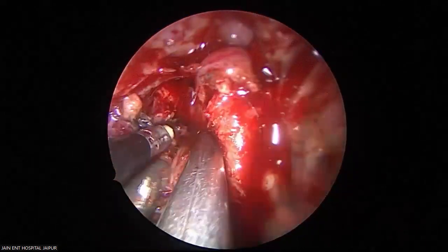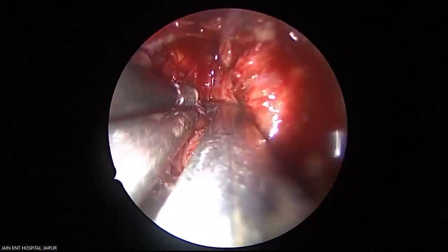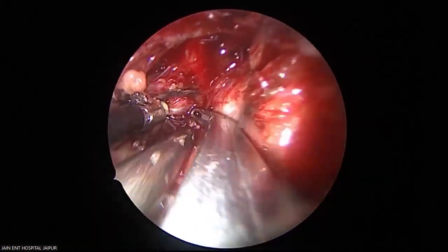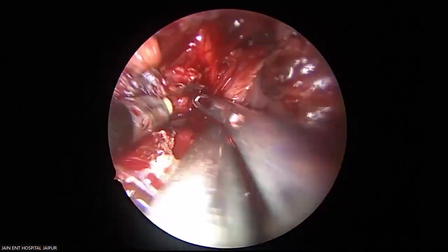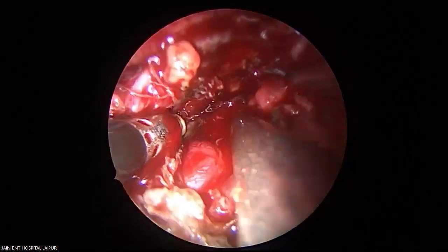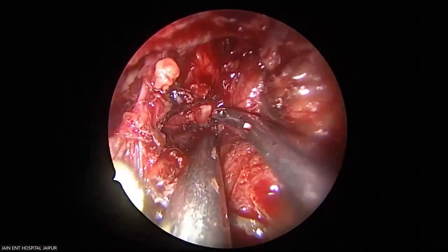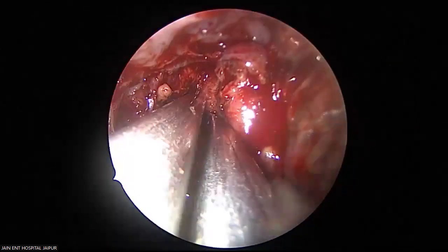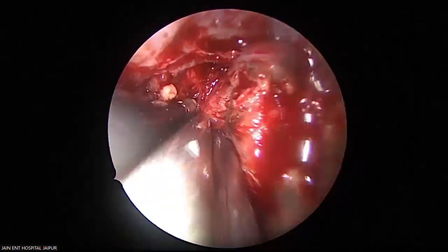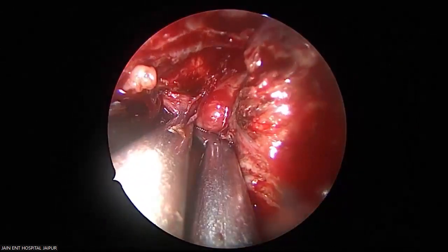Just keep opening up the space because I'm far laterally to take the trunk of the vessel. We have to make a space to put a clip or anything in that. Let's define first.